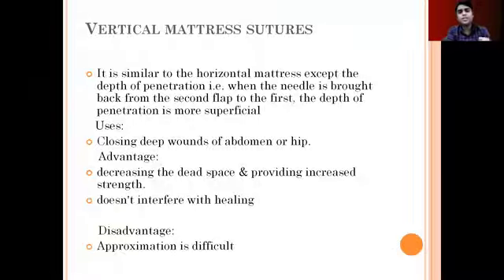It is used in closing deep wounds of the abdomen or hip. Advantages are that it decreases the dead space and provides increased strength. It doesn't interfere with healing.